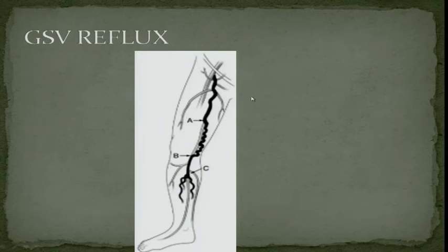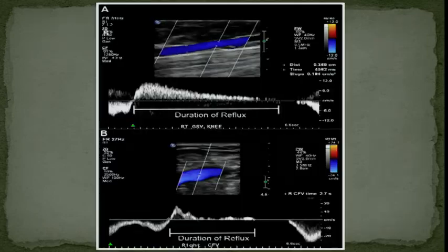Sometimes, even before you put on the color flow, you can tell whether or not this particular patient will have venous reflux. Number 1, by looking at the patient's lower extremity: are there tortuous varicose veins? Number 2, when you do the grayscale evaluation, if the great saphenous vein is dilated, you are more than likely going to find reflux. If the great saphenous vein is dilated, invariably there is reflux. I'm just going to show you these examples and then we're going to go there.